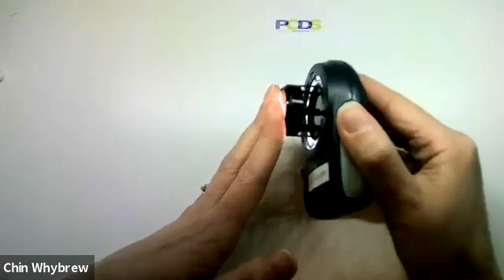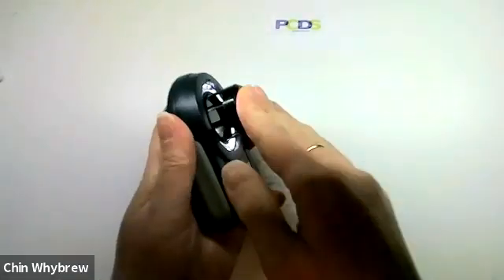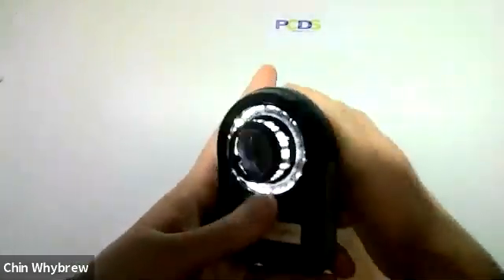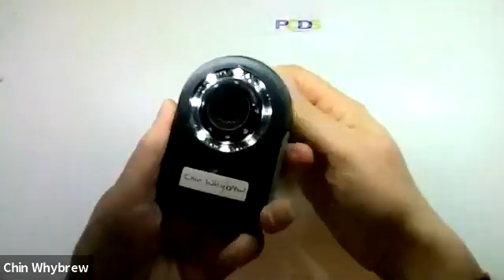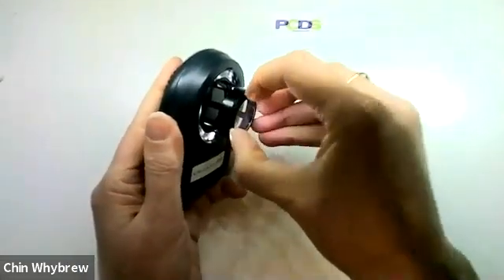Now, these have an end plate that screws off, so you have to actually unscrew it to remove the end plate. And that can be rather a difficult process to do.